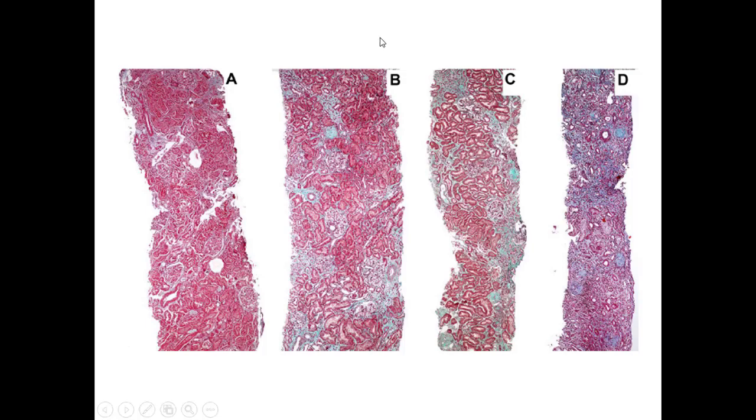And this is the other idea of the low power and other significance. This is a trichrome stain, as I mentioned before. So here, if I see the blue color, here it's very minimal, and here it's mildly more than this. Oh, it's a moderate fibrosis. Here is a severe fibrosis.